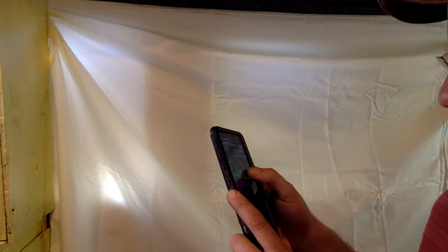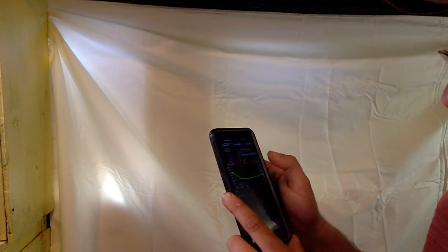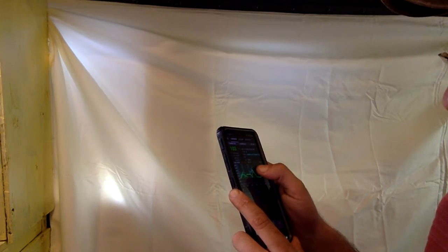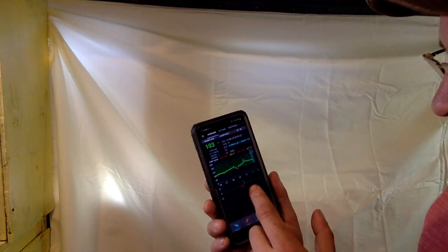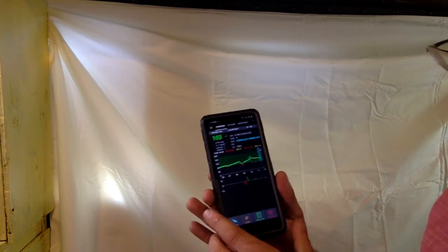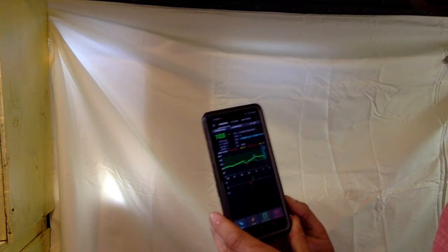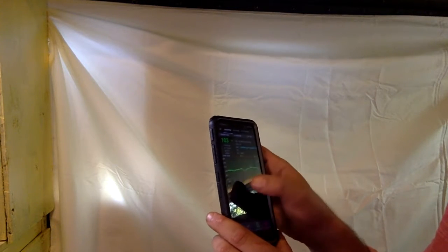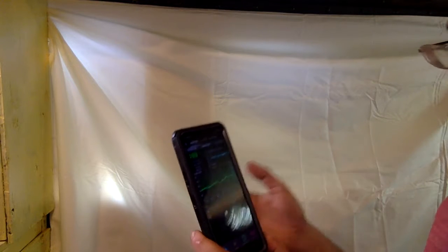Deviations. Deviations are cool. So deviations, you can get green, gray, and red. Oops. I want the colors to be a little bit big. Green means that the insulin didn't quite do as much as the system expected. Red, it did more than the system expected. So the red, I went low. So my settings are not correct.